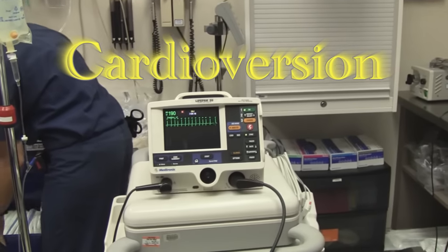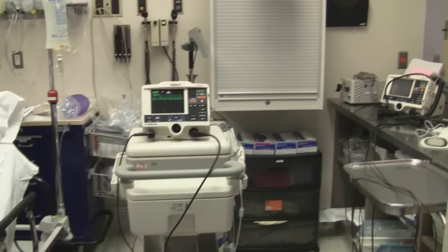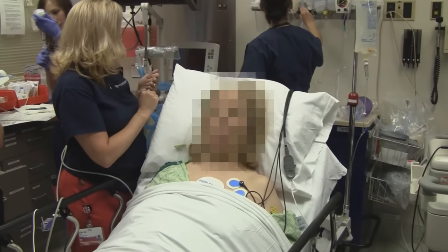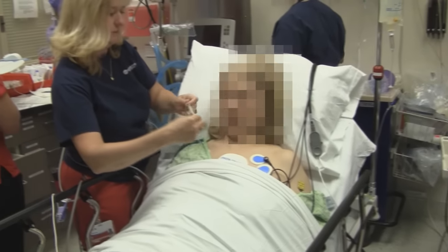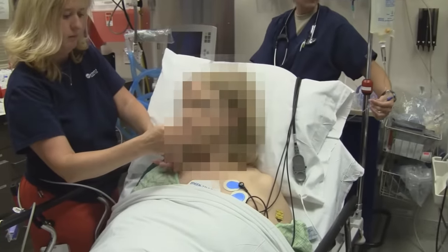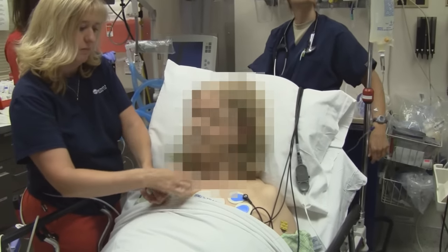We're going to be doing a cardioversion here. We have an atrial flutter going on. This is our patient — we're going to blur her face. When did your heart start beating fast? About 11:15 today.